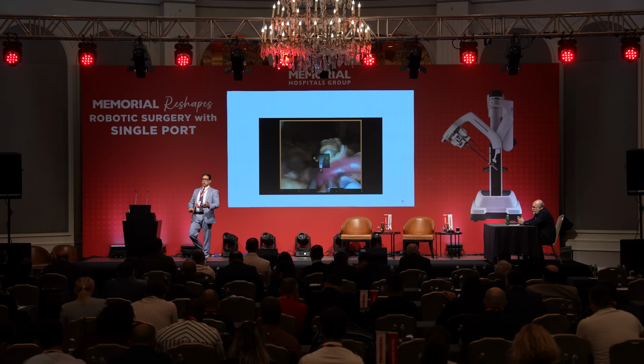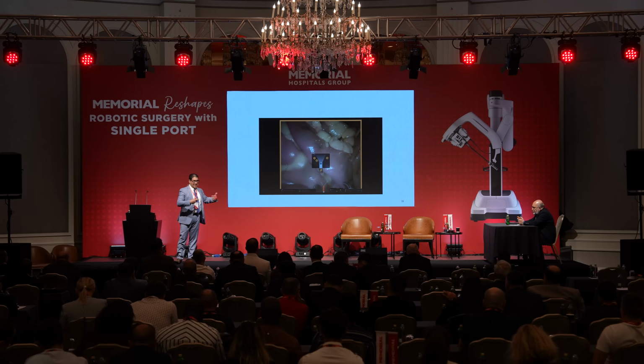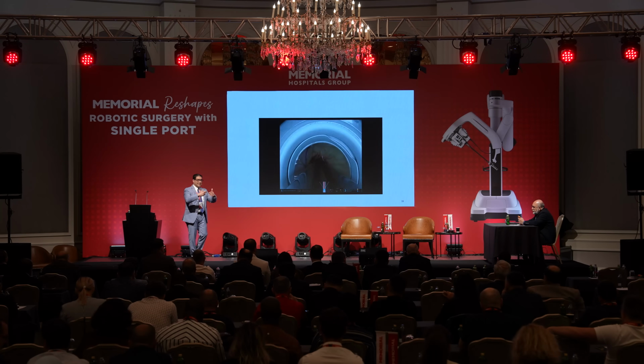So one of the things that you need to train on in the simulator is to learn how to read the avatar. I had a problem in the beginning until I learned how to read it, and it made me understand what's going on with that triangulation inside the abdomen.